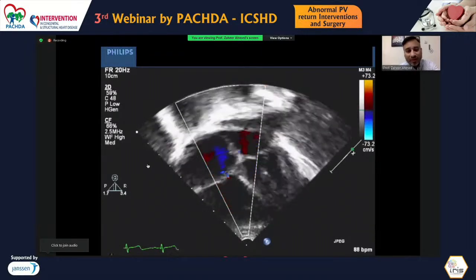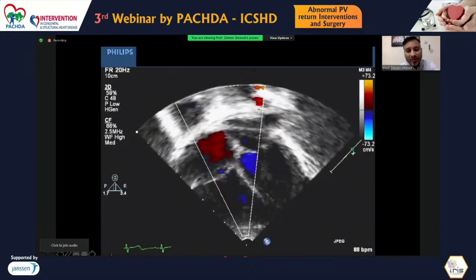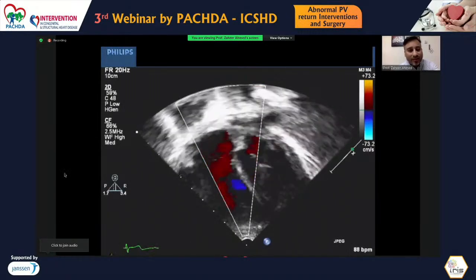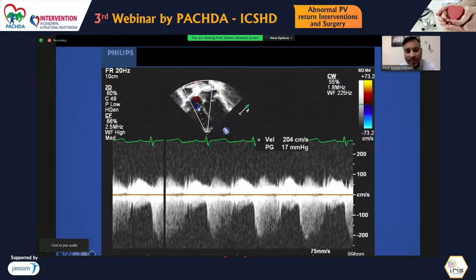This patient had a significant aortopulmonary collateral, which was occluded, and this is an echocardiogram 6 months down the line, and you could see there is less dilatation of the right side of the heart with a mild TR, and there's significant regression of the pulmonary hypertension. So again, signifying the importance of aortopulmonary collaterals, that they need to be occluded.